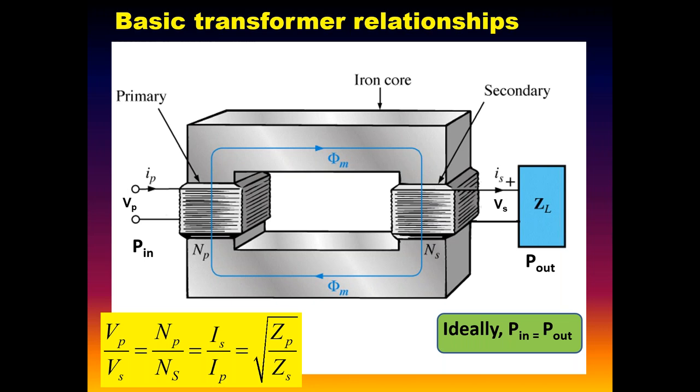That's why if you ever look closely at a transformer, you'll see it's laminated. There are sheets of iron, but they've got a varnish coating on them, an insulating coating, and that coating is designed to reduce some of those eddy currents. And then the third loss is called hysteresis. It's almost like a form of magnetic friction, maybe. It's from the reversal of these little magnets, and it creates the total loss. But all of those collectively contribute to the warming up of the transformer. And frankly, the cheaper the transformers, the more undersized they are, the hotter they get. So if you ever have to replace some of these or design something new, the more you can oversize it, the cooler it's going to be.